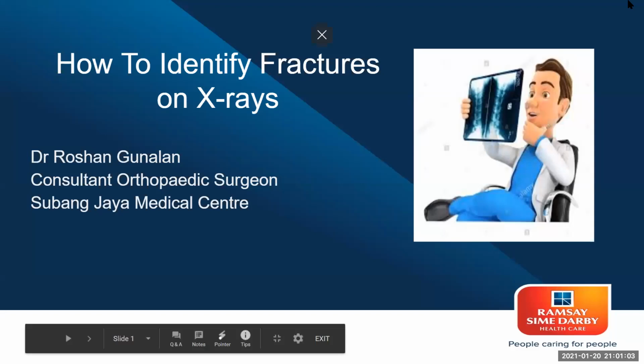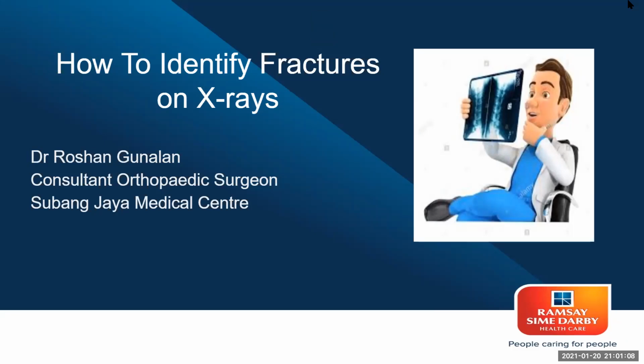Right. So Dr. Roshan is a consultant surgeon with Subang Jaya Medical Center. He is actually a trained pediatric orthopedic surgeon. But today he's going to speak on how to identify fractures on X-rays.